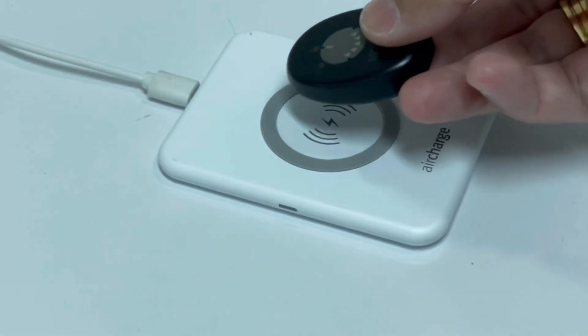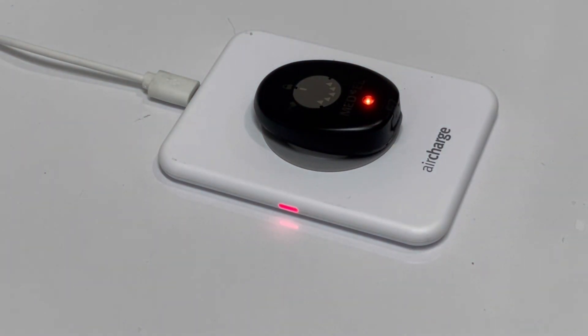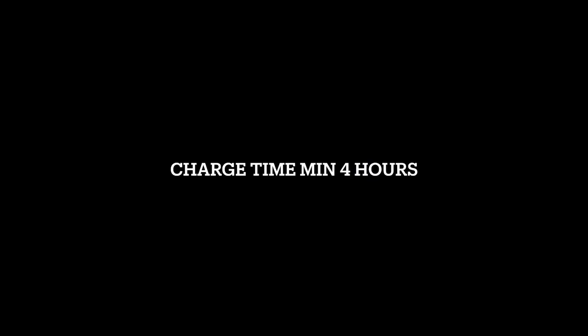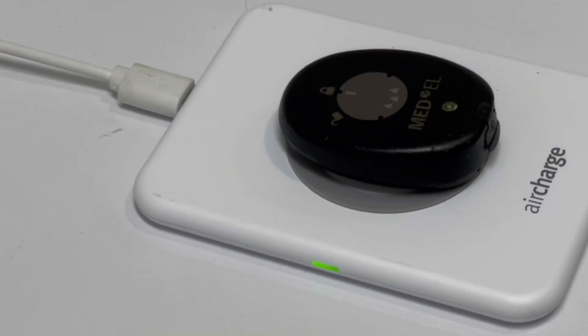Then from here, you need to put your processor upside down and a light will appear showing that it's charging. After 4 hours, the light disappears, meaning it's fully charged.